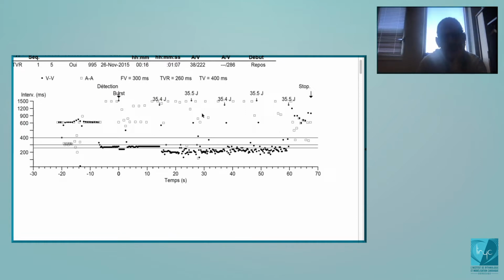So if you observe that, are you surprised to observe that? No. Okay, you see, that's the problem with the ICDs. The patients who have the higher risk of induction of ventricular fibrillation are also the patients who have the higher risk of non-reduction with maximal energy.